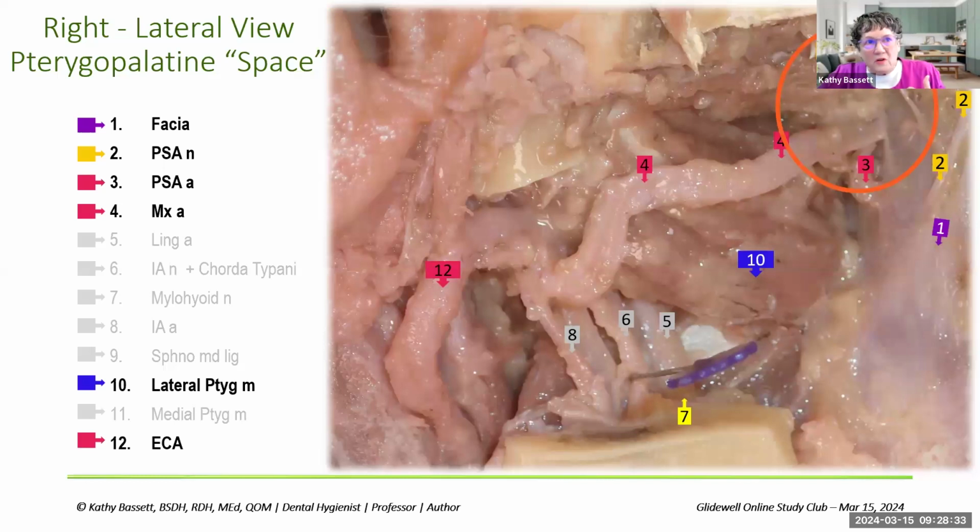In the gray, those are the nerves we talked about last month. So just kind of for perspective. And I like this picture because I'm one of those people where it doesn't matter if you give me a PSA or you give me an IA, I'm going to get some anesthesia of both because my anatomical proximity is really close. So it's a good opportunity to remember that when patients tell you that, for many, those things are very close and you are going to have enough anesthetic in that area to impact adjacent nerves. Okay, now I'm going to pull in even closer just here.